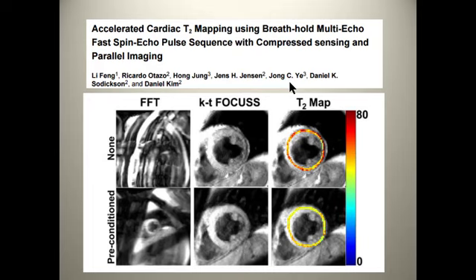And we all know fast spin echo gives you very nice images. So fast spin echo is limited in the time. So there's a couple of approaches to deal with that. So some of these very rapid, clever approaches of compressed sensing and combining data through time, because what we're going to have to do is collect all those phase encodes, but you also have to collect a series of echo times. And the downside of a spin echo method is that you need to wait a reasonable time for recovery. So the cost of that is you're struggling to fit that into a single heartbeat. So this data uses these accelerated methods to do that.